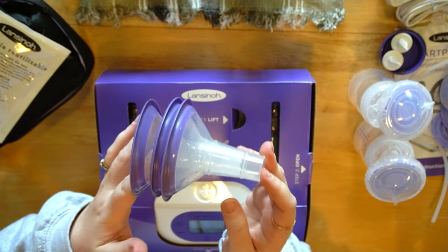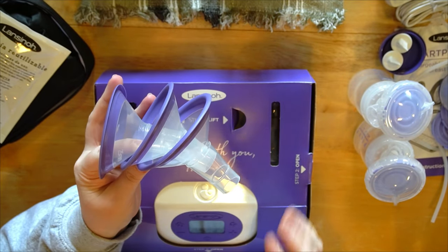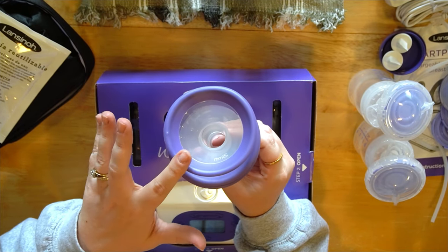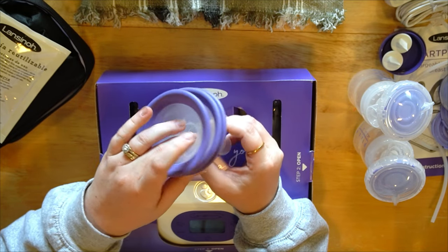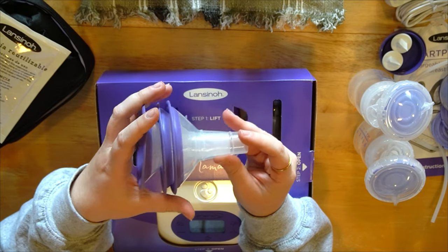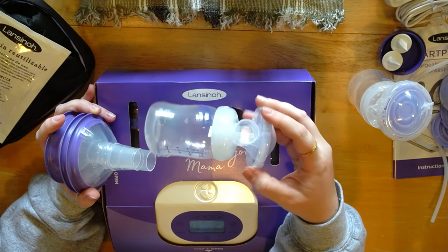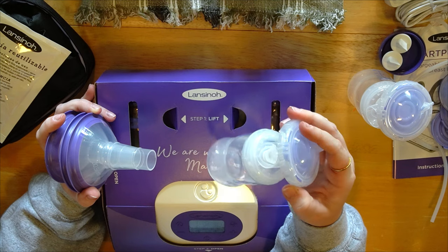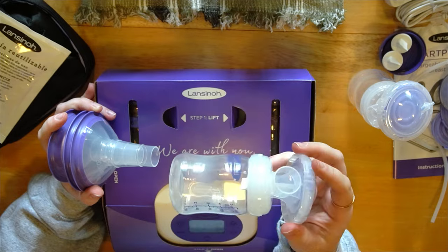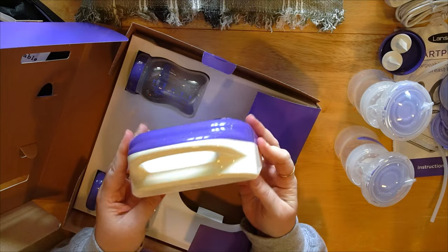This is the 30.5, this is the 28, and this is the 25. Lansinoh used to include just two sizes, so now we're up to three — that's really awesome. I would love to see even more; a size smaller than the 25 would be really cool. Personally when I used Lansinoh pumps I was a Medela size 21 millimeter flange, and the Medela flange at the time did fit, so in case you need a smaller flange you could always give a different size a try.